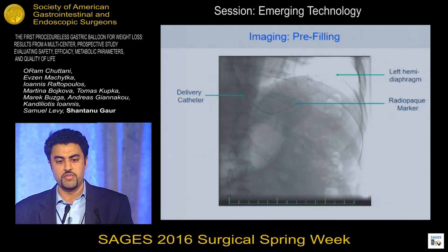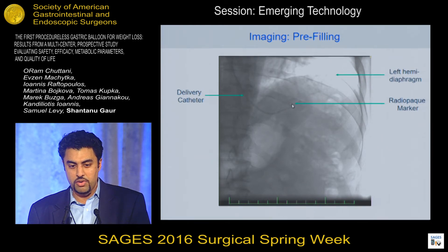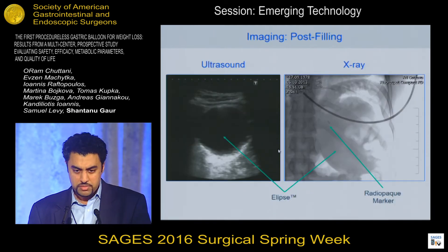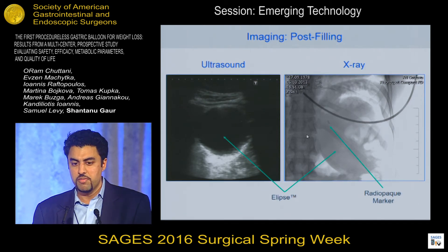Here you can see an x-ray of the balloon prior to filling. You can see the delivery catheter, which is also radio-opaque, entering the stomach, and there's a radio-opaque marker on the inside of the balloon. You can even make out the faint shadow of the capsule. Clearly we're under the left hemidiaphragm, so we're inside the stomach and ready to start filling. Filling takes about six minutes start to finish, and after filling, you can clearly see the balloon on ultrasound and the radio-opaque marker inside the stomach on x-ray.